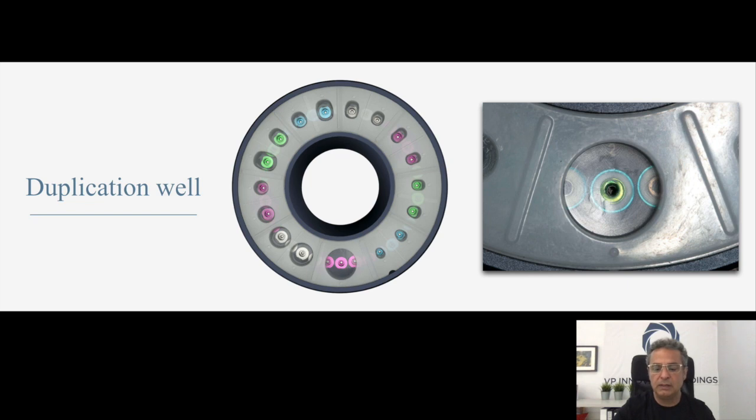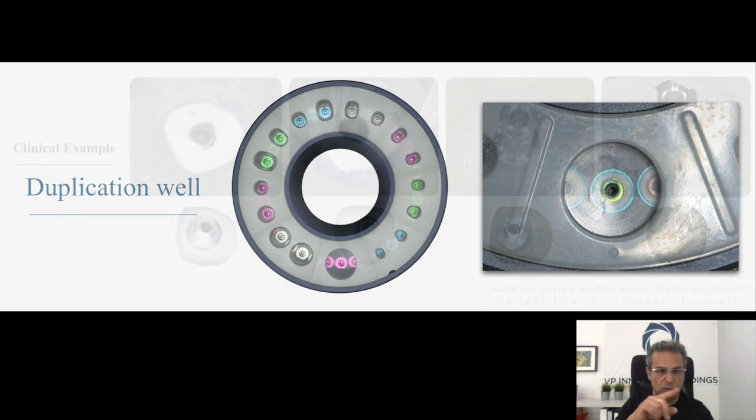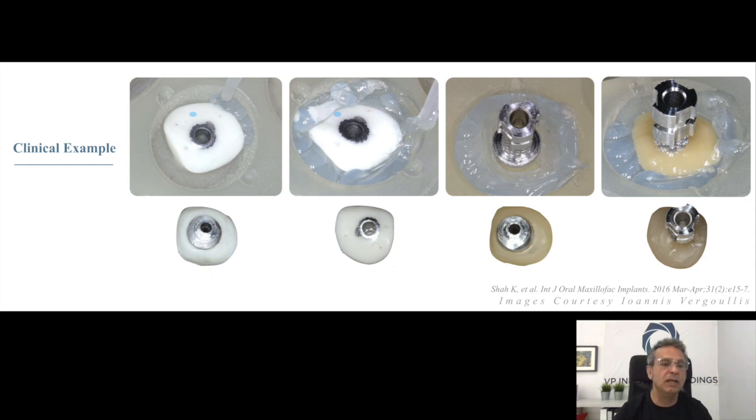I suggest that you smear the actual well with some Vaseline, then you position in the healing abutment. Tighten it down to your analog, which is in the base, and then you inject clear silicone around and allow it to set. Remove it, give it back to the dentist so that he can put it back into the patient's mouth so we don't get any tissue collapsing and whatever. And you have time and ease to create your custom impression post. Once your impression post is ready, polish it up, get it ready, quick switch and everybody's happy. It's a very simple process.